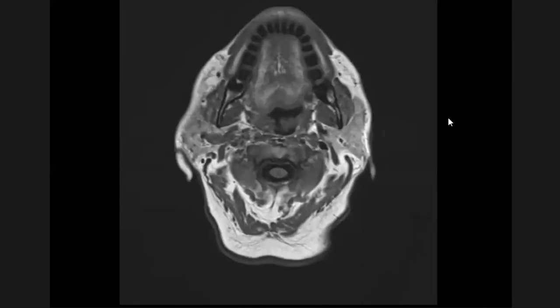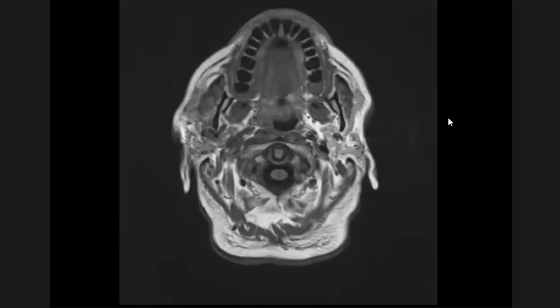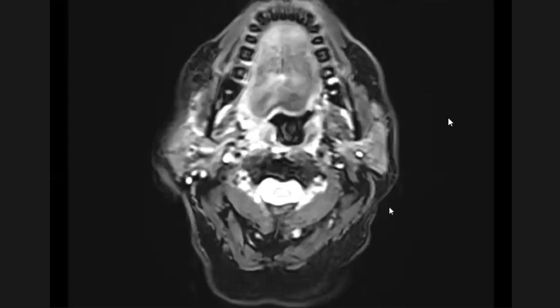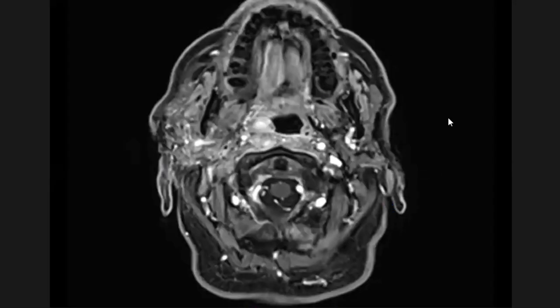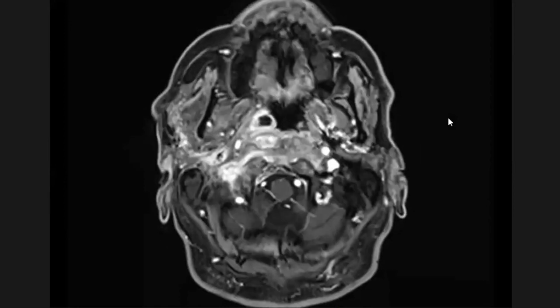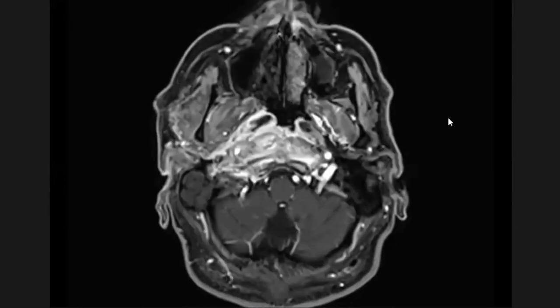So this is the next series of the images. Initially I showed you the T1-weighted images, and now this is post-contrast T1-weighted images with pertinent findings.